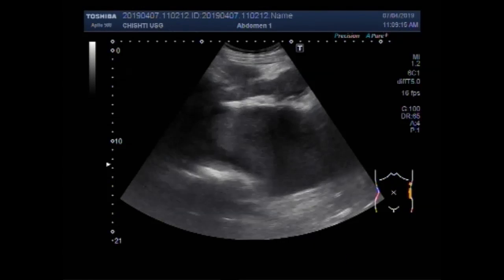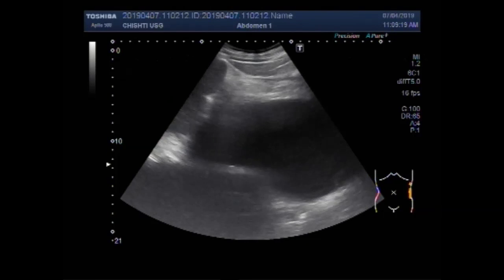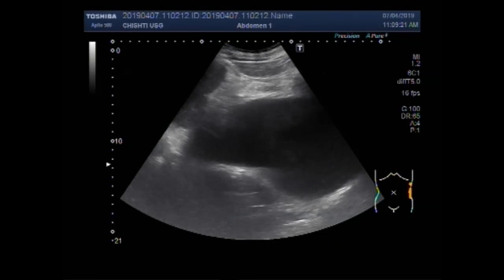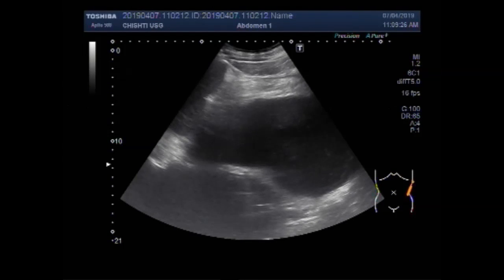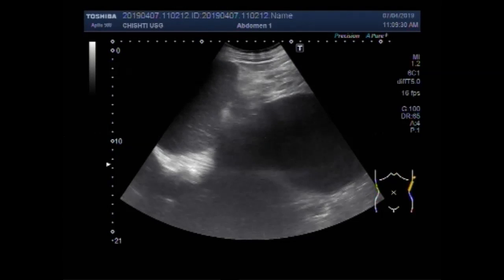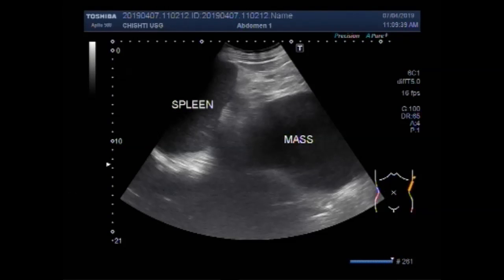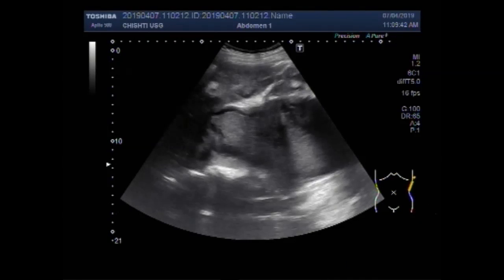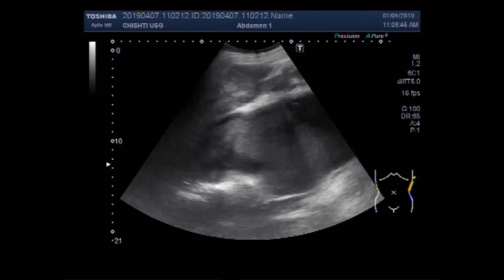Now you are going to see the left renal angle. Here you can see the spleen and a large mass in the normal anatomical position of the left kidney. This is the plane and this is the huge mass — the kidney is invisible in this area.